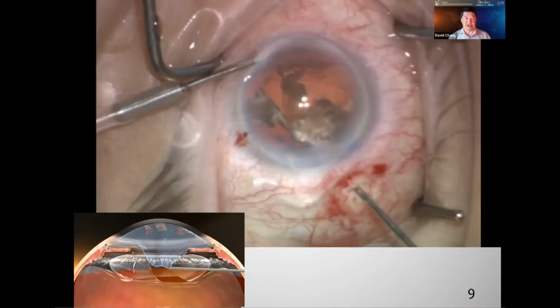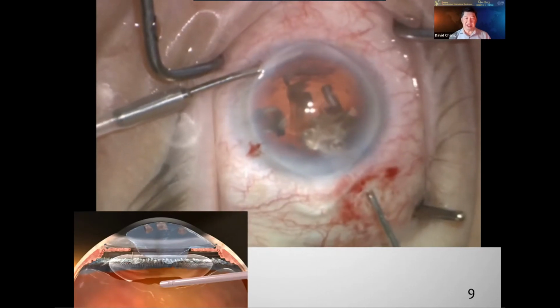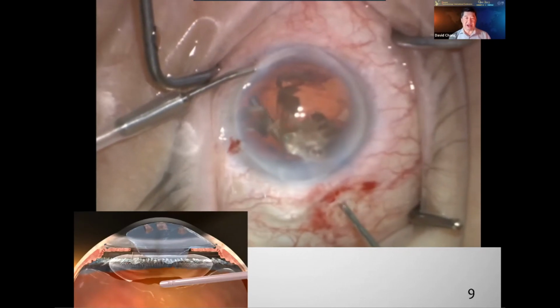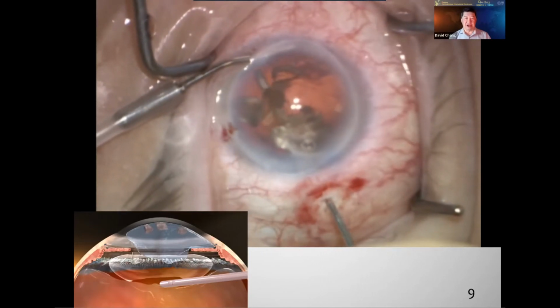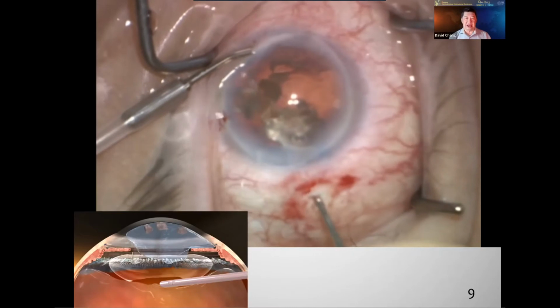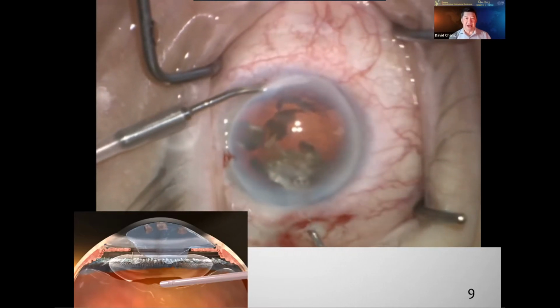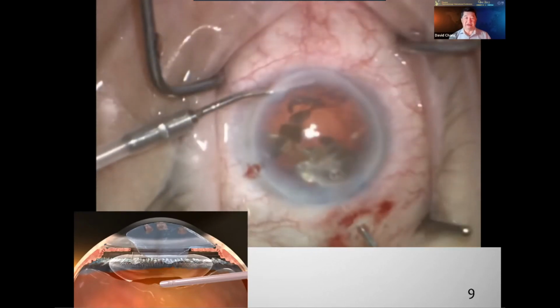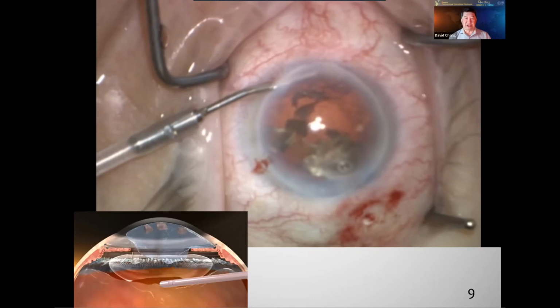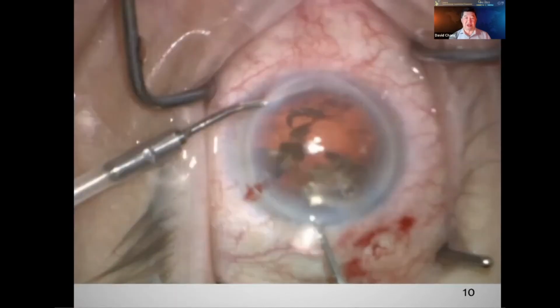Now when I go in to do my vitrectomy, this is the phase I'm at. I'm staying behind the iris, sort of behind the level of the posterior capsule, and sweeping along. I make sure that I amputate any prolapsing strands of vitreous. Look at how the pieces do not move with the circulation, even though I have an anterior infusion cannula, and that's because I've trapped them with the viscoelastic. Now we can address the pieces.